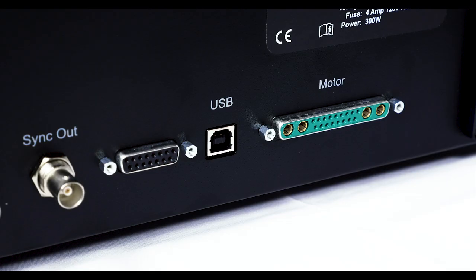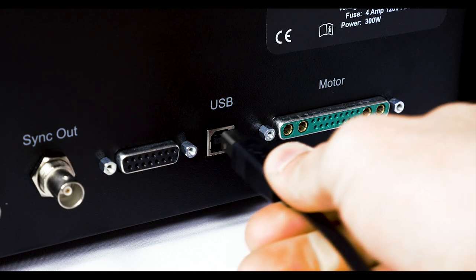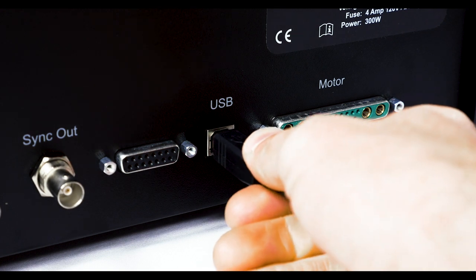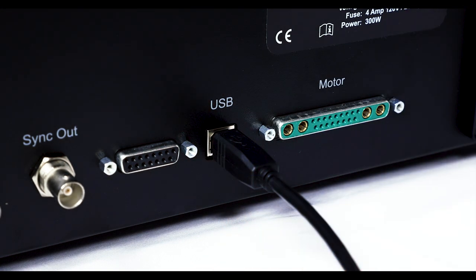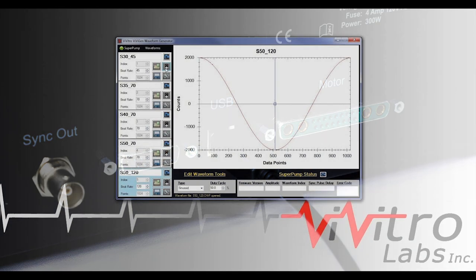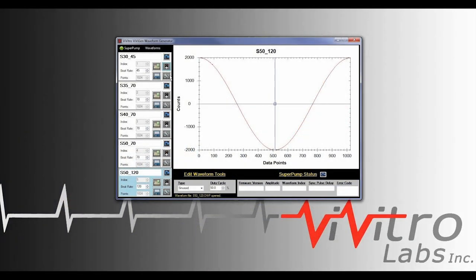Waveforms are uploaded into the super pump controller by connecting the super pump controller USB port to a PC. Vivigen software is then used to program the controller waveforms.